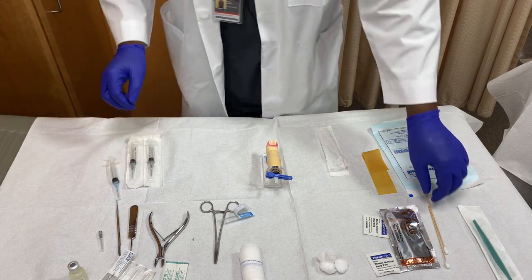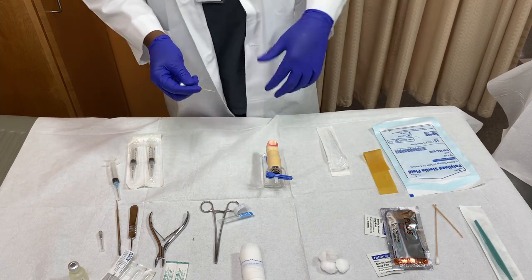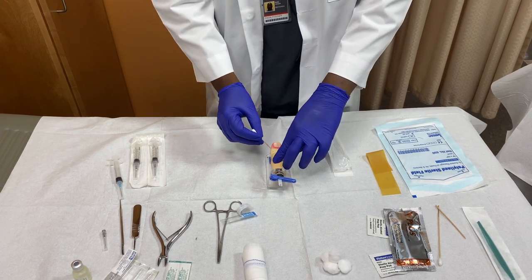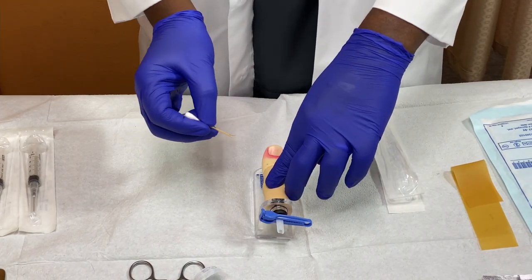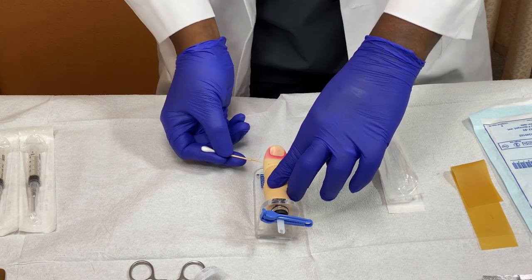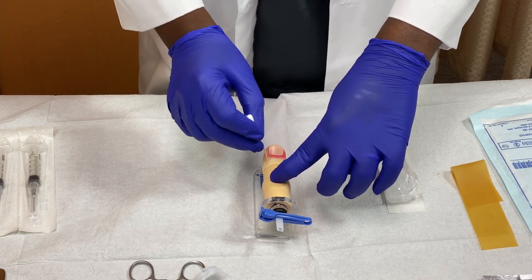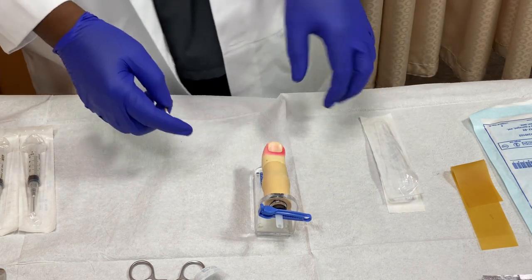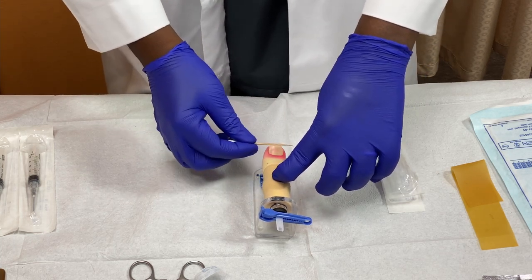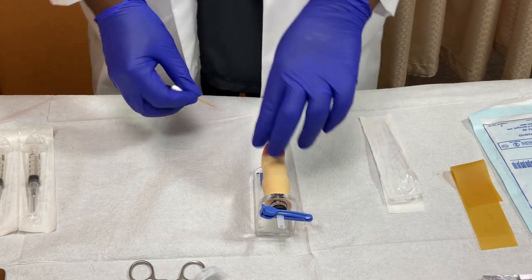After completing the nerve block, wait five to ten minutes — most patients probably need ten minutes, some even fifteen. Then test for sensation: snap something sharp and prick various parts of the patient's toe to ask if they feel any pain. The answer you're looking for is no. Prick all over — not just the region of inflammation — to make sure the whole area is anesthetized. Remember, you are anesthetizing the two groups of nerves that run on either side, proximal to the nail, and what is distal will be affected.